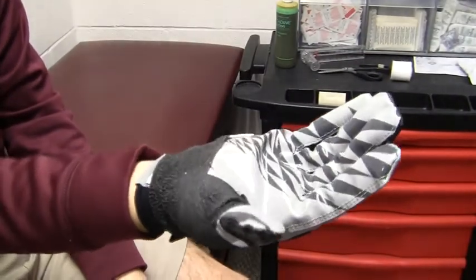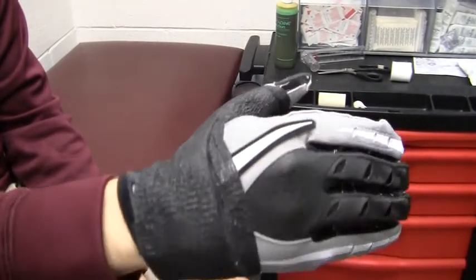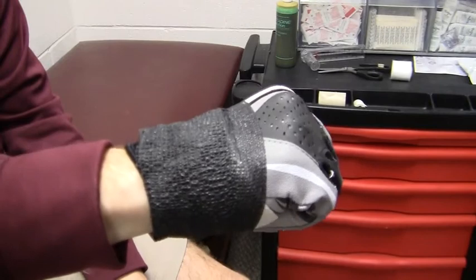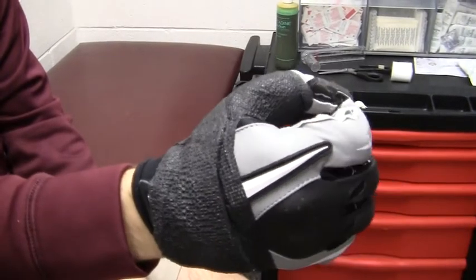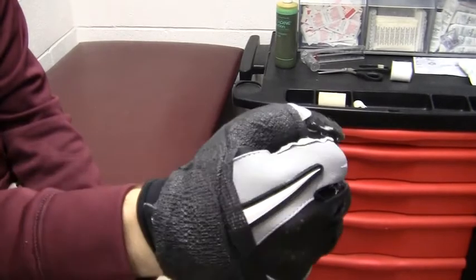Once the cast is secured to the athlete's hand, have the athlete move their hand around to ensure comfort. The cast should protect against extension and abduction of the thumb's MCP joint. Any further modifications that need to be made should be addressed before the athlete begins practice or competition.